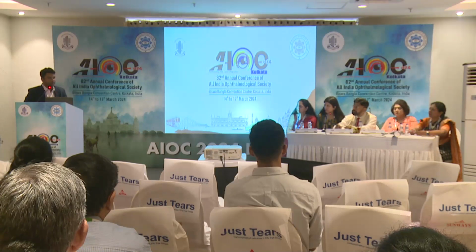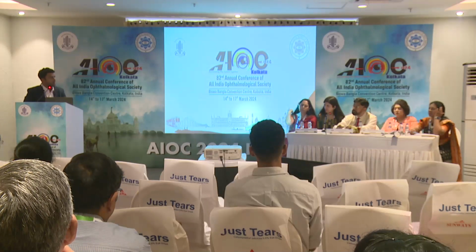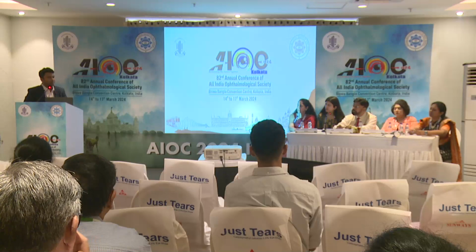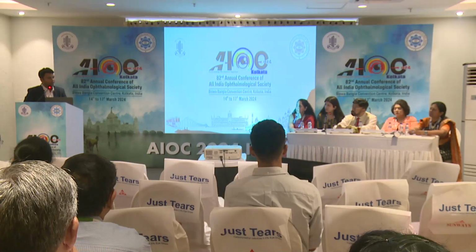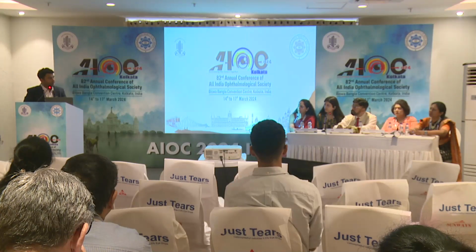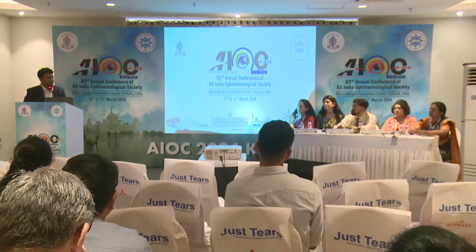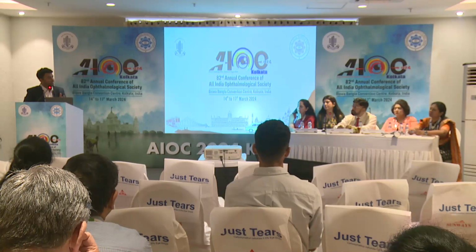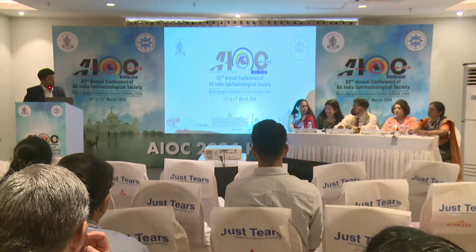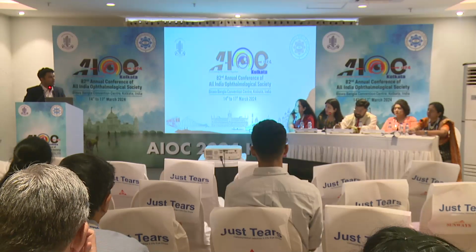But what we can also do in our practice is use the white to white as a consideration. What we routinely follow is that white to white of 10.5 would be eligible for a CTR size 11. Up to 11.5 would be eligible for a CTR size of 12. Up to 12.5 would be eligible for a CTR size of 13. You can do the same with an axial length also. Less than 24, 24 to 28 and more than 28. Exactly, correct. So these are the parameters we routinely follow during our practice.